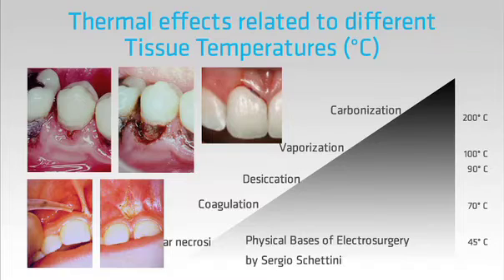As the temperature scale rises, the tissue proteins become quite sticky. We will need to remove tissue debris from the tip by gently wiping it. At this stage, the tissue begins to shrink. At 100 degrees Celsius, water boils, so the water in cells will boil and we will get vaporization. The wound will have a yellow-brown edge, just like the gingivectomy shown on the upper left. This sun-tanned looking surface is what we want to see, all brown and very little white or black.